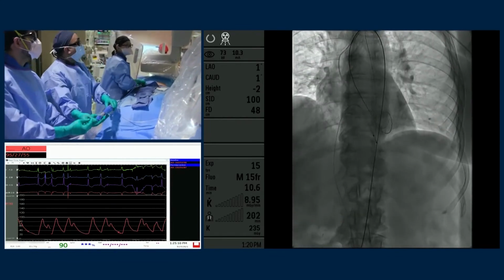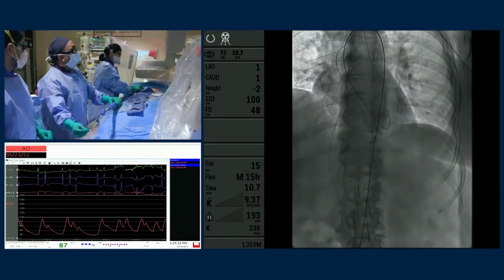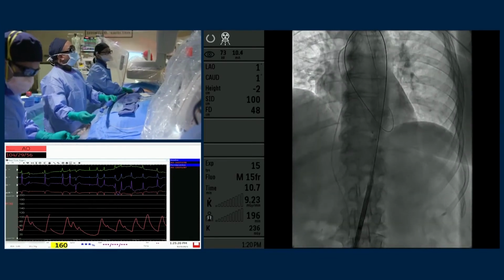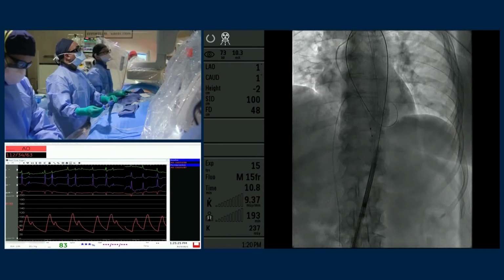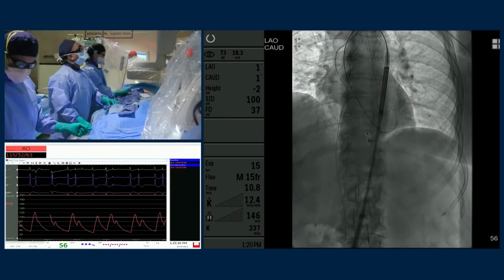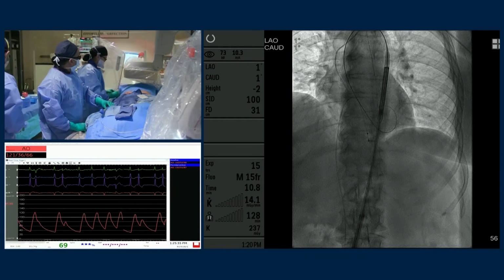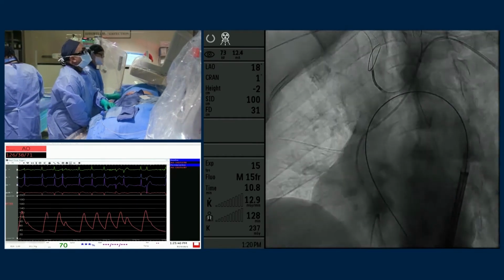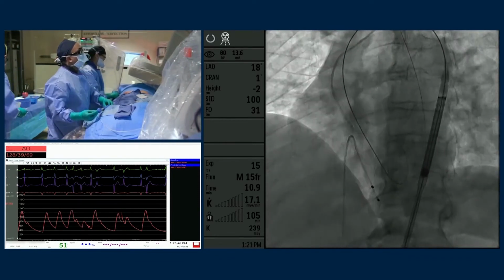Okay. Good, I've got wire. Is it going in easily, Mei? Okay, good. So, what we're going to do is once Mei comes up a little higher on the descending aorta before crossing the arch, we're just going to mag up a bit here and look at our hat marker. I'm going to go into LAO view, so it's best to go into LAO view here. So, I'm just going to rotate a bit to see where our hat marker is. And you can see the hat marker there.